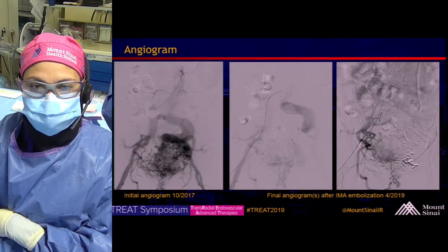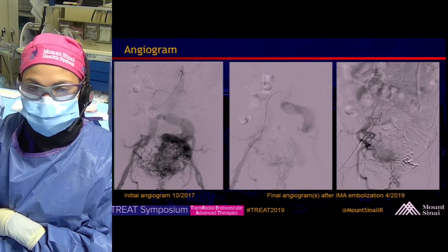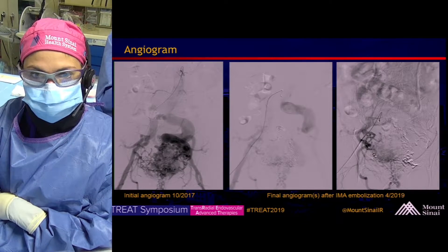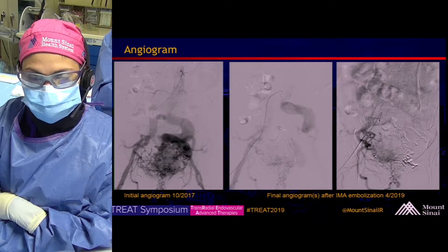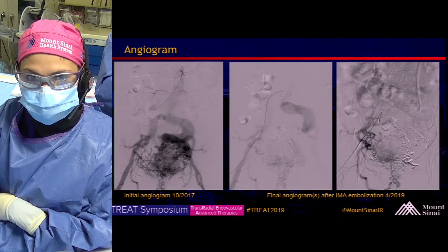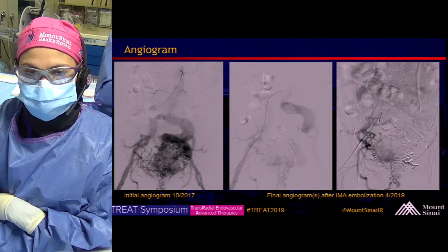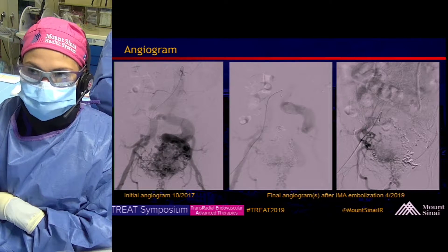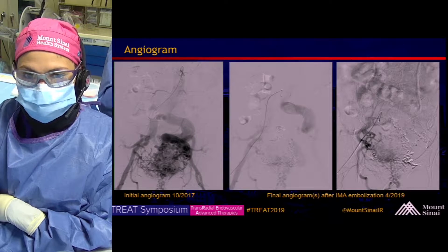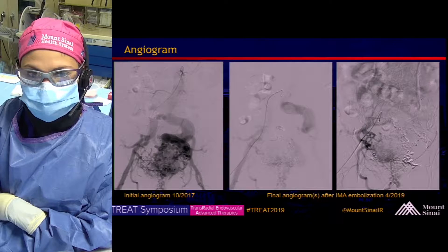The angiogram image all the way on the left is his initial angiogram from the aorta. You can see multiple feeders from bilateral hypogastrics. The IMA feeders may not be as obvious on that picture, but were present at that time. The middle and right images are from the just-preceding embolization about one month ago. You can see there are still multiple residual feeders, one of which we're going to attack today.